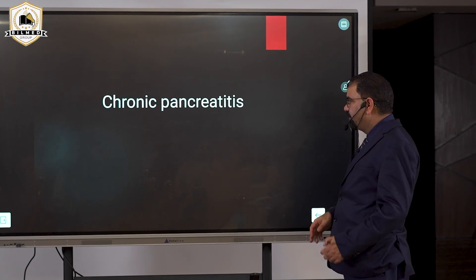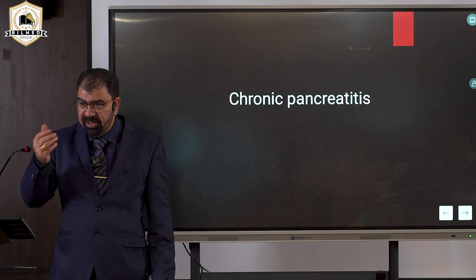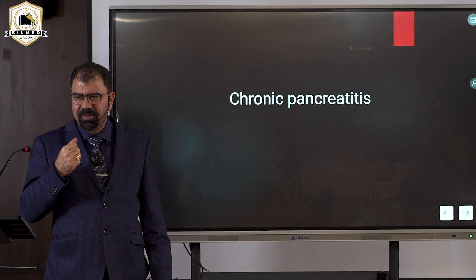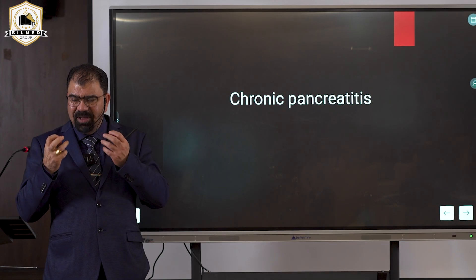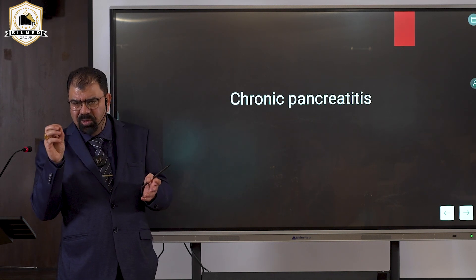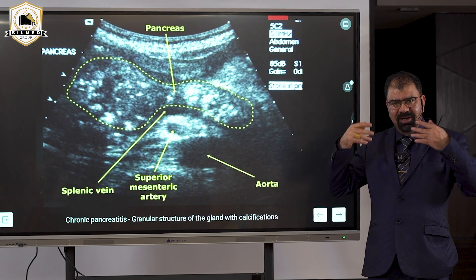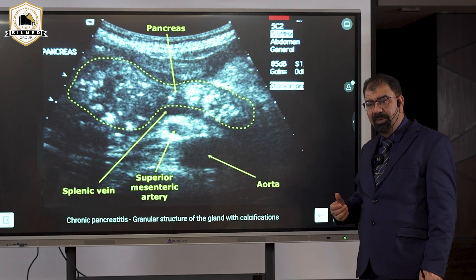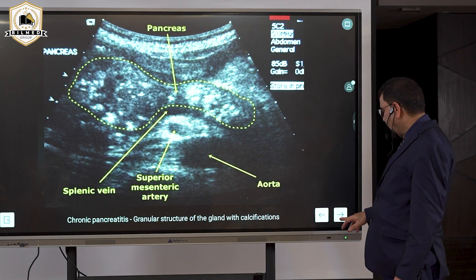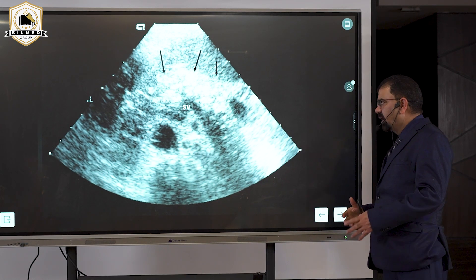In chronic pancreatitis, you expect increased echogenicity with small calcifications throughout. Imagine the picture: there will be an echogenic pancreas with multiple small calcific foci. This is chronic pancreatitis — you will not expect much size increase, but you will see increased echogenicity with calcified foci scattered throughout, as visible in this image.